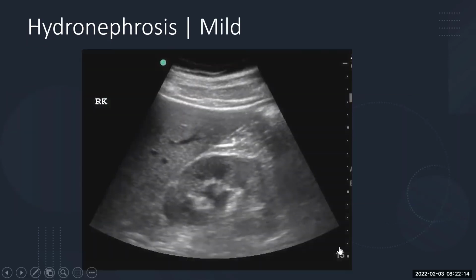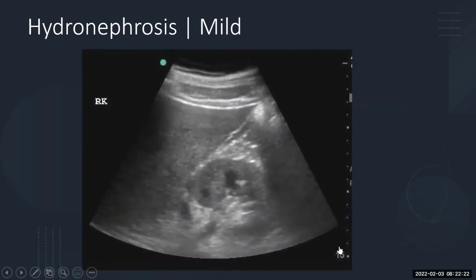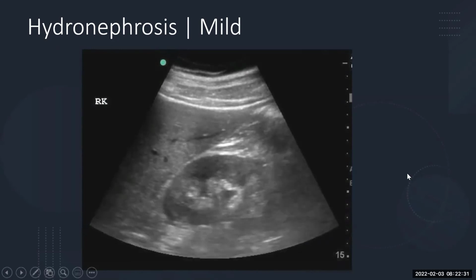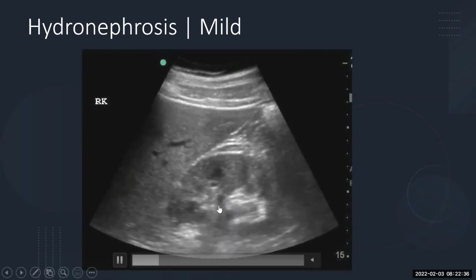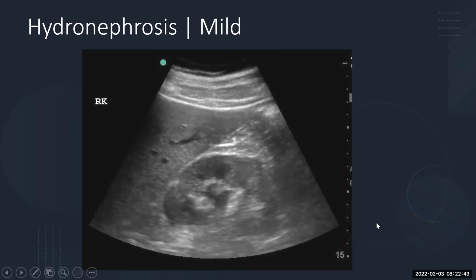And then moving on to what we usually use the renal ultrasound for in the emergency department, that being hydronephrosis. So normally the renal pelvis is this very hyperechoic or white area within the kidney. It's uniform. You can see the pyramids above there. Hydronephrosis represents that distal obstruction, which causes a ballooning up of the kidney. And you'll see a little bit of this black or more hypoechoic region in the renal pelvis that's representing hydronephrosis.